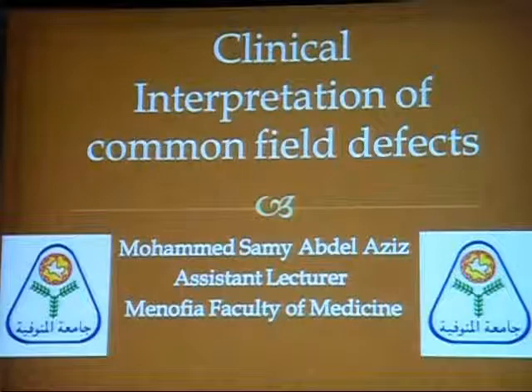First of all, I would like to thank Professor Dr. Mustafa Nassar for allowing me to use his visual field printouts for this full demonstration.